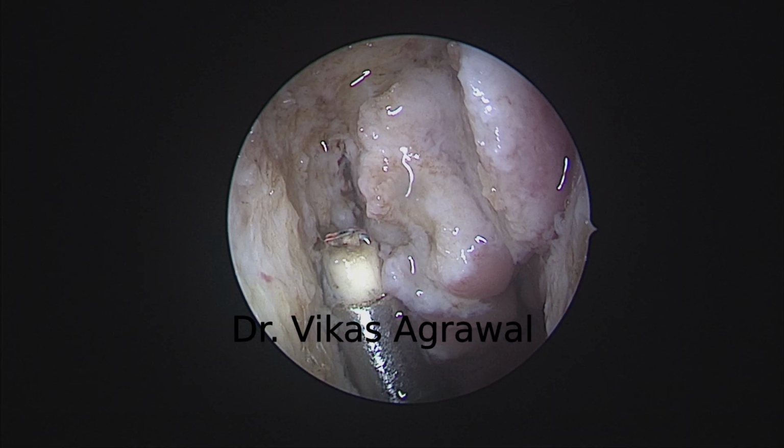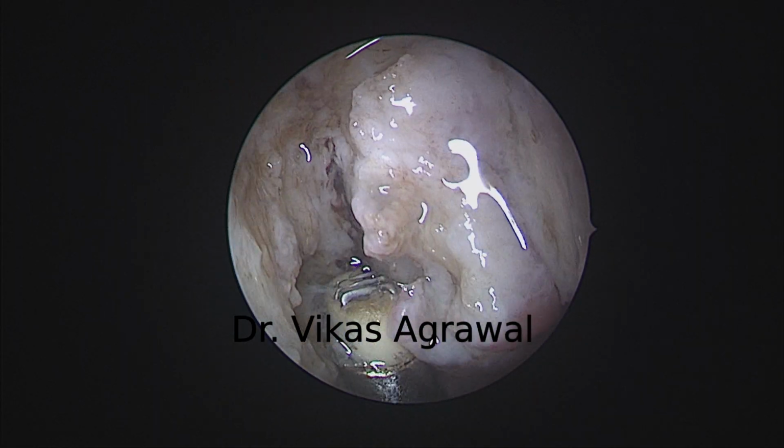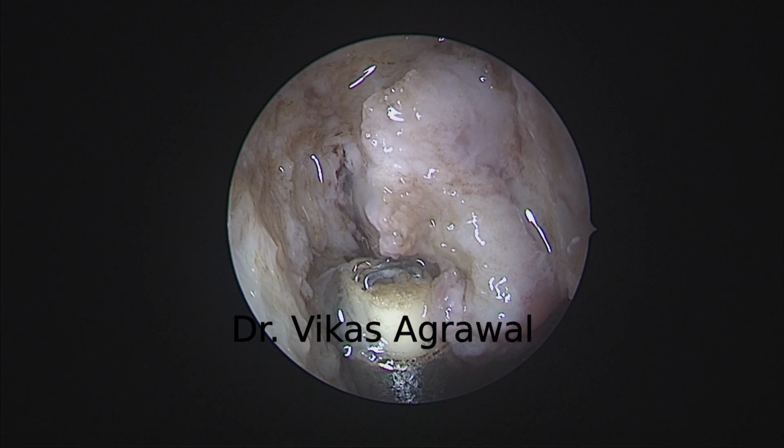So laterally, you have to be a little more careful. Now see how much of depth is still there. That's the whole point.